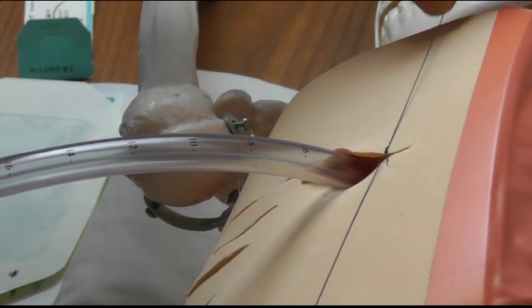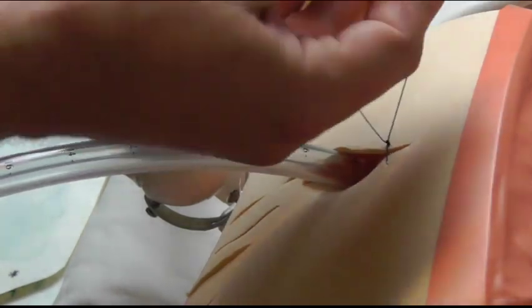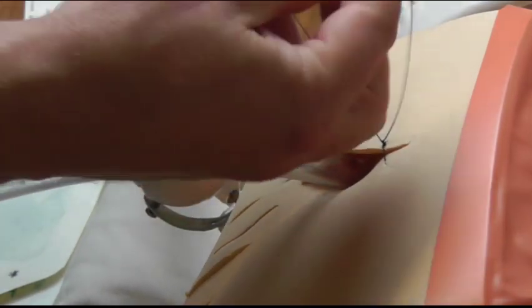Bring it down and tie it close to the skin. You're stitching the skin back together here. You don't want it to be super tight, but you don't want it to be loose either. So, you've done one stitch.